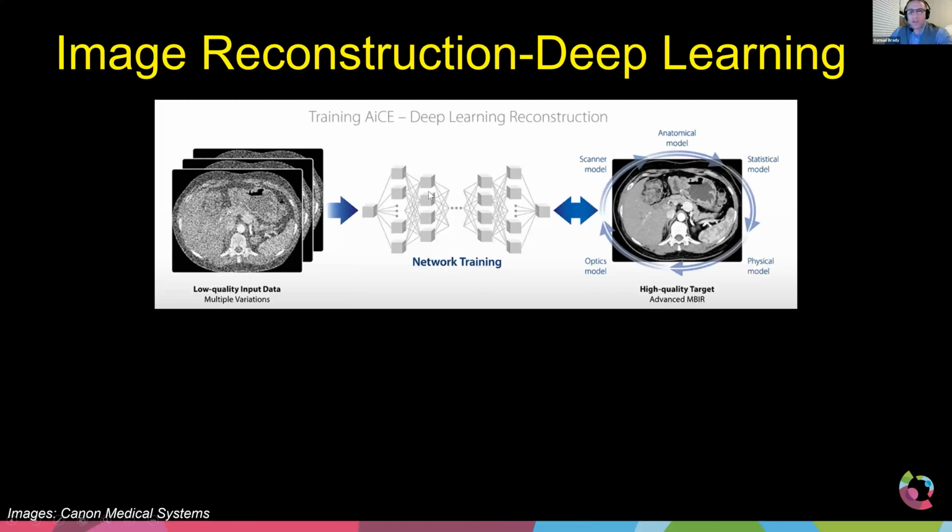Well, we can create software that has these same type of neural connections. And so it has a way of taking an image, decomposing it into its most basic structure, learning about that basic structure and putting it back together. And that's what a neural network is. So deep learning is that network right here.